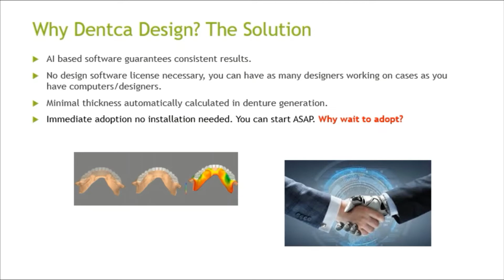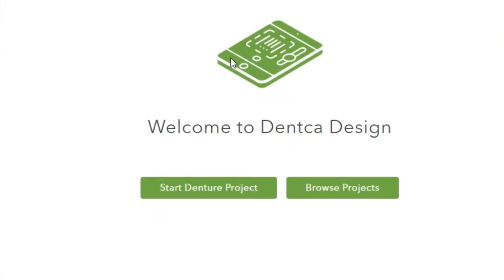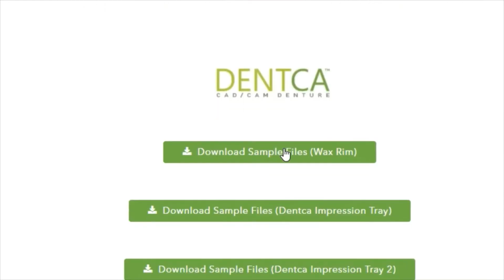So with no installation needed, no fees needed, you can start ASAP. Why would you wait to adopt? If you would like to design cases with the DENTCA Design software, visit dentcadesign.com. On the main page, you will be able to find a DENTCA Design tutorial video which explains fantastically how to use all the features of the software, as well as sample files that you can download in order to try out how the system works.